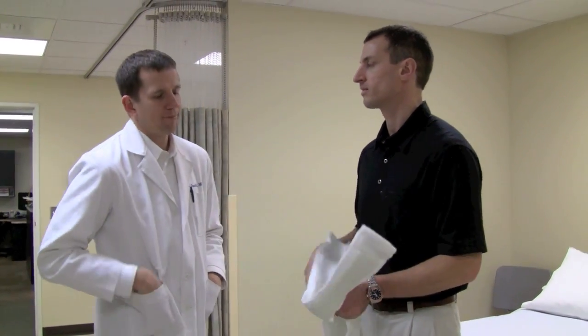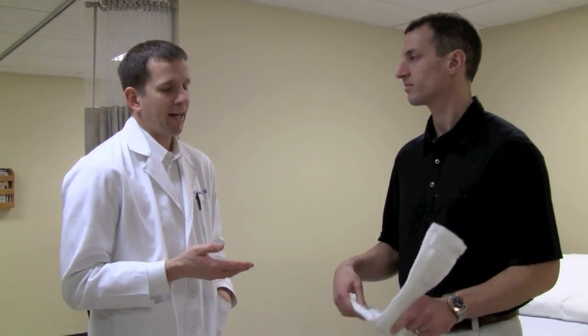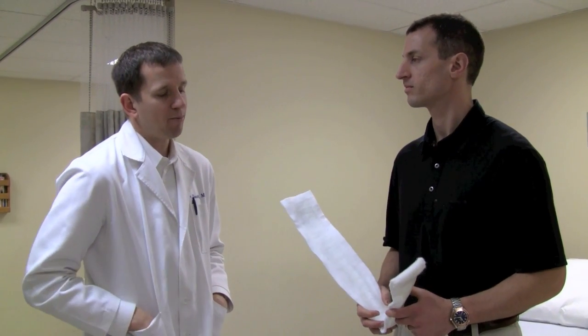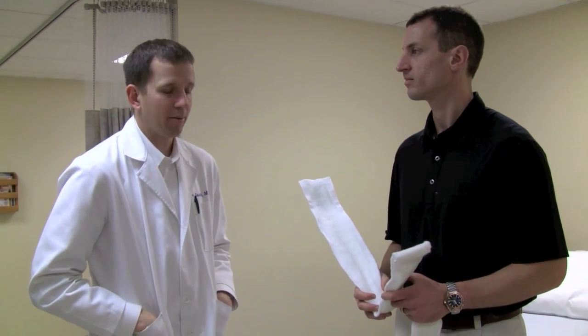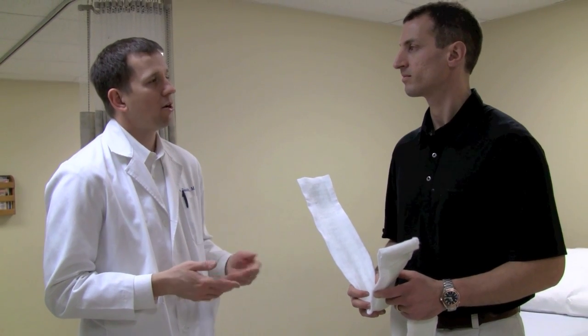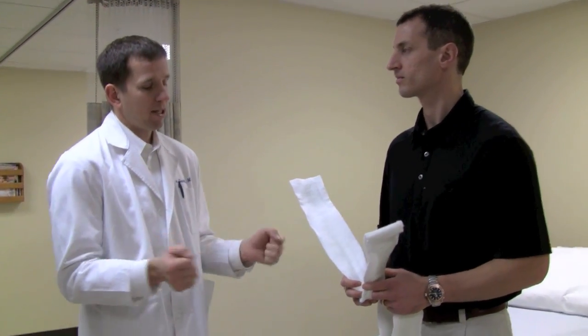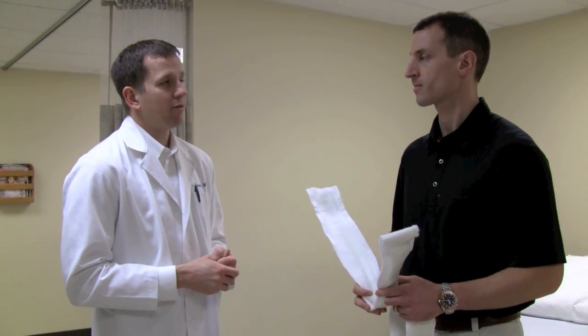For an Achilles injury, or even an ankle sprain, just a posterior splint is probably fine. A non-displaced ankle fracture is also probably okay. Anything that needs to be reduced in the emergency room needs the stirrup on it for sure.